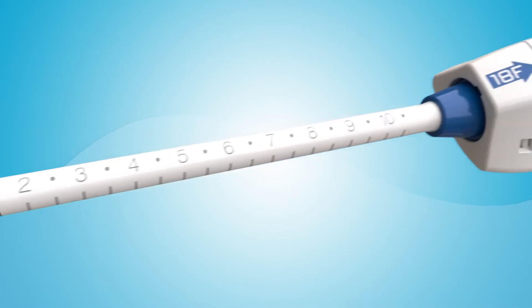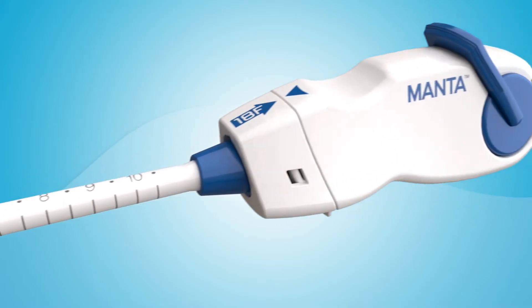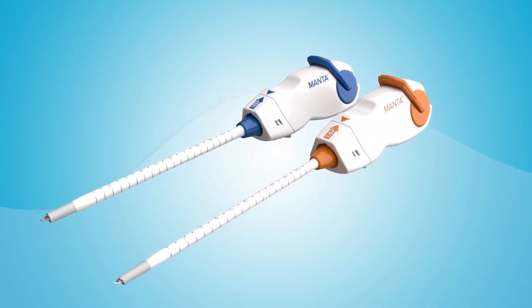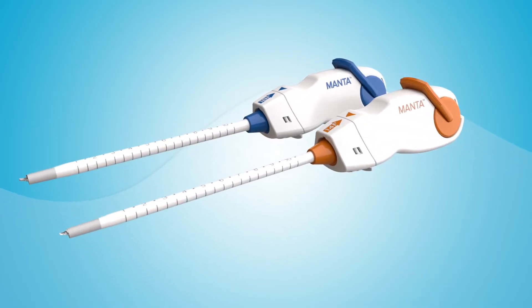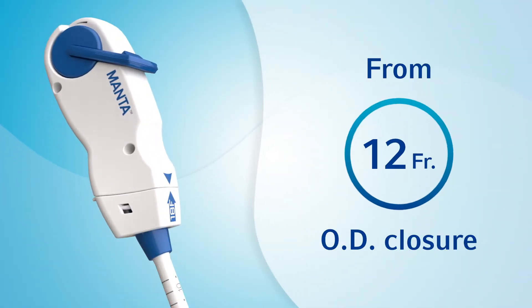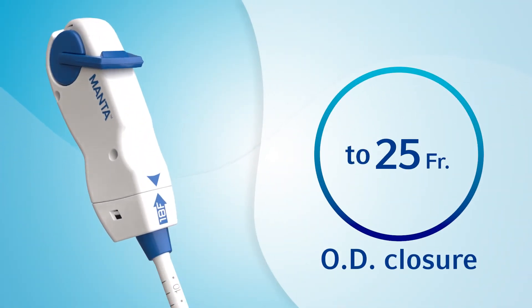Enter a new era in large-bore closure with the Manta Vascular Closure Device, a device designed specifically for closure of large-bore femoral arterial access sites following the use of devices or sheaths ranging from 12 to 25 French outer diameter.